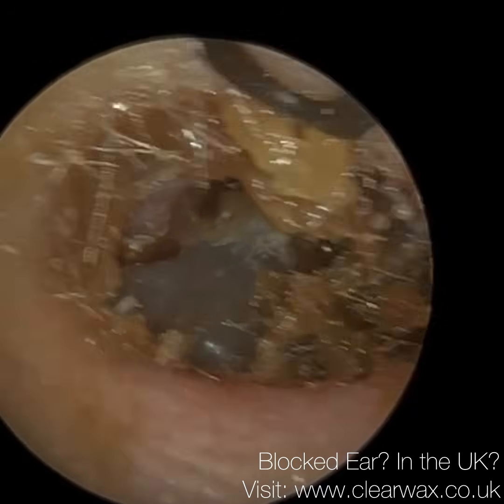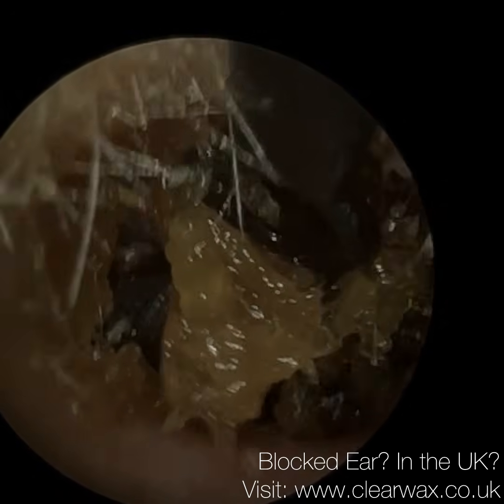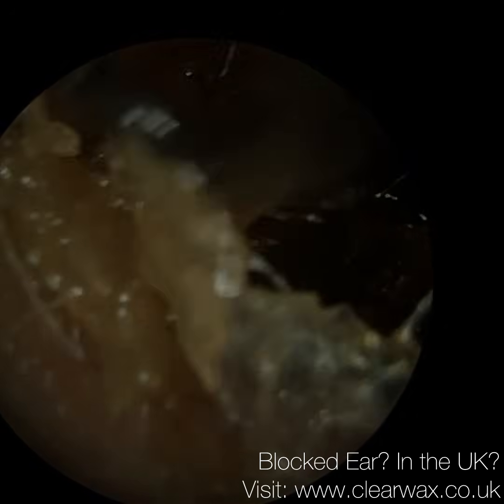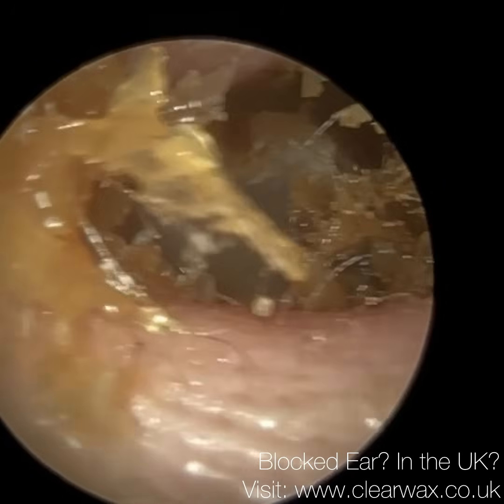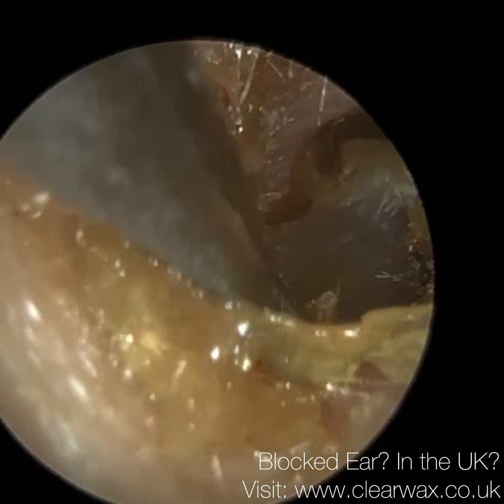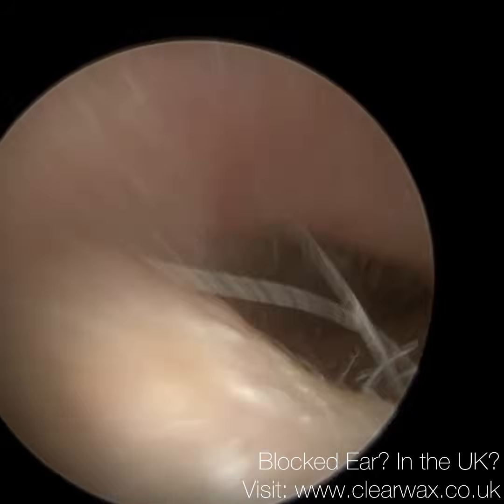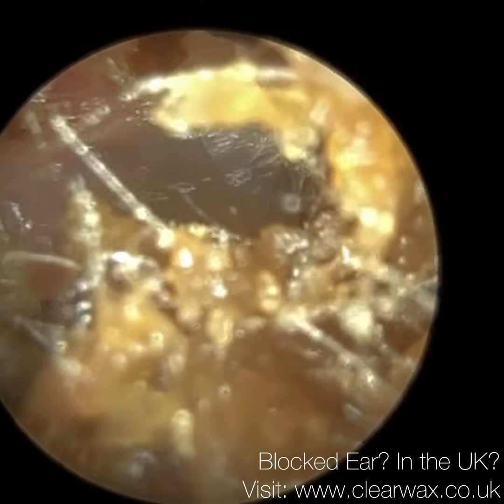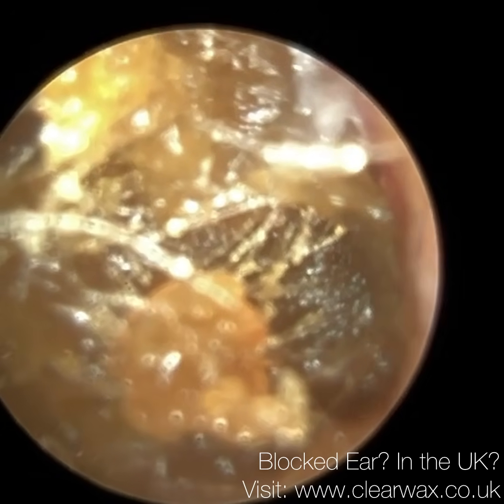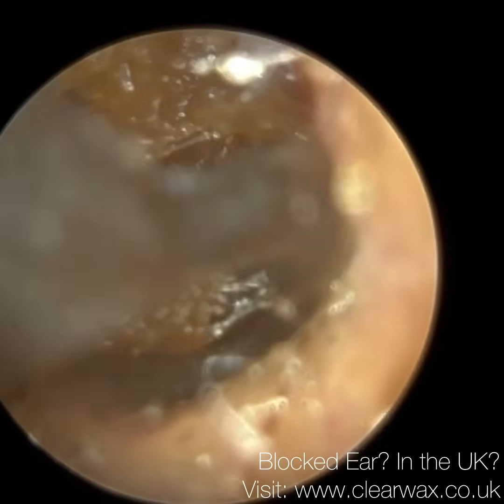And quite often in cases of benign osteonecrosis, the ear canal is not blocked, like in this case. With an external auditory canal cholesteatoma, typically you have an ulceration of the skin that's lining the floor of the ear canal. It's a local destruction of the ear canal wall, but it doesn't have to be at the floor. Typically it does occur at the floor, but it can also occur at the front wall of the ear canal, the back walls, or the anterior and posterior canal walls.